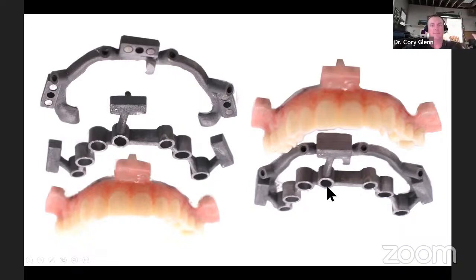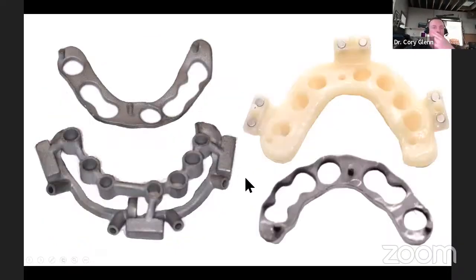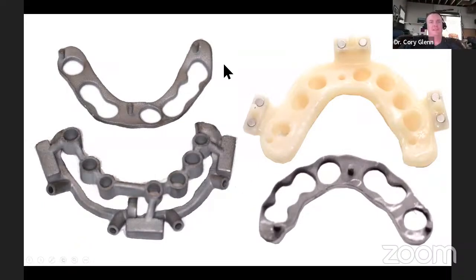That's just my preference. Okay, so you can see here how the drill guide magnetically seats onto this. I believe this was for BioHorizons implants, hence the different tube shapes. But then once you've delivered that and you've put on your temp cylinders, this temp will magnetically seat on as well into the same little magnetic interface, and you can just pick up your cylinders. Now, this was a new addition.